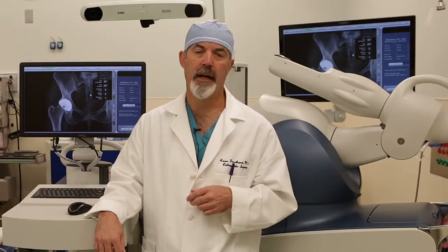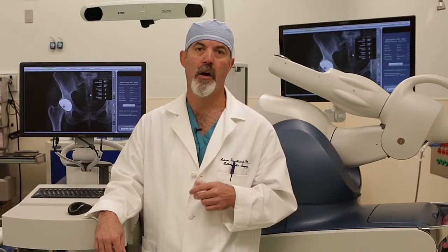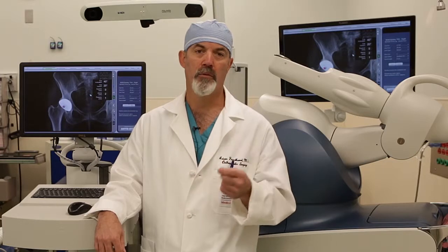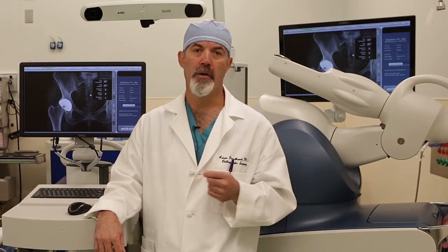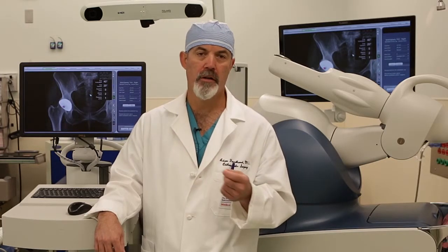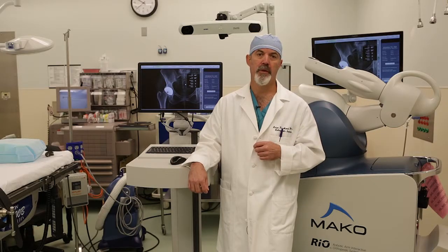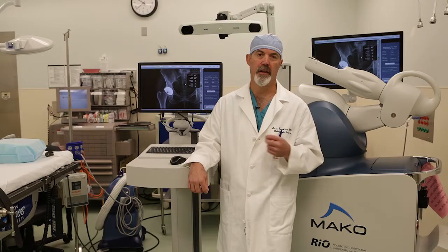The outcome, I think, is obvious. If you're cutting only things that you plan to cut, you're minimizing surgical trauma. If you're able to really accurately measure the bone that you're removing for a partial knee or a total hip replacement, or soon to come a total knee replacement, the obvious is that you should be able to get better outcomes for your patient utilizing these tools.